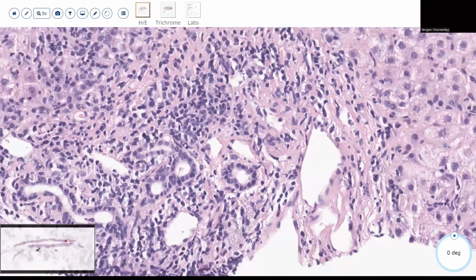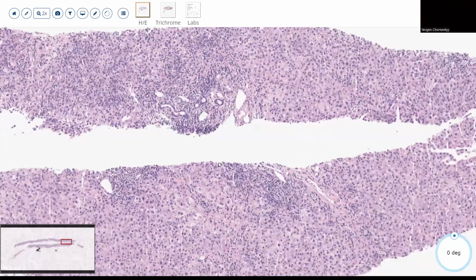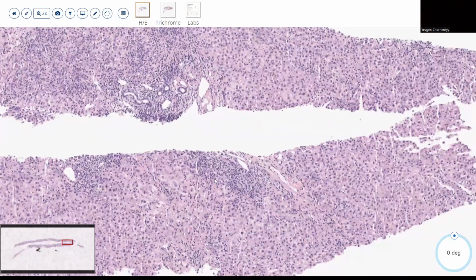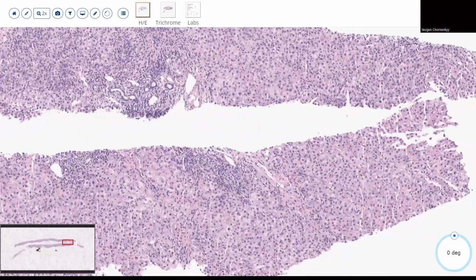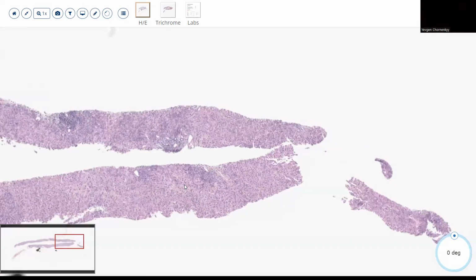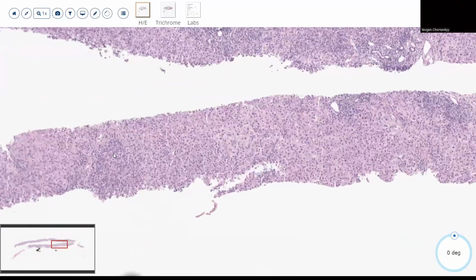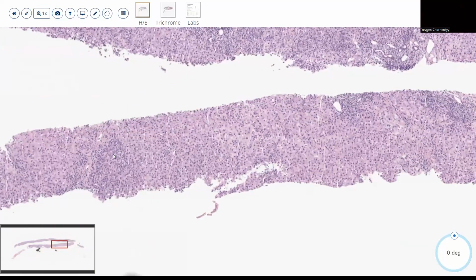So generally, what you guys are saying, you're on the right track. When you're seeing this, plus those antibodies, you should be concerned for some sort of autoimmune histology. And because we're seeing biliary duct damage as well, and some cholestatic kind of damage, and because of the antibodies, you're thinking about maybe an overlap syndrome.